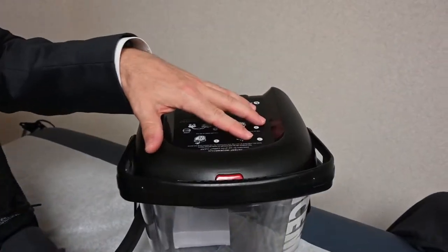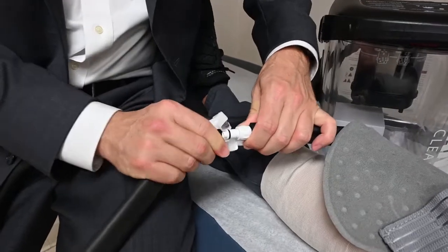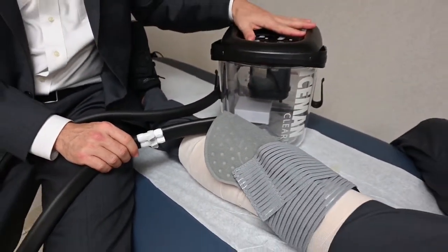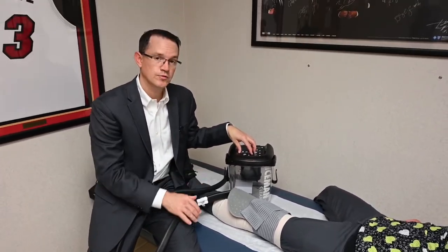When you receive the unit, you want to first fill it with ice water. You then want to plug the tube into the end of your pad and then plug the unit in. Upon plugging the unit in, it will automatically start to circulate the ice water through the polar care.